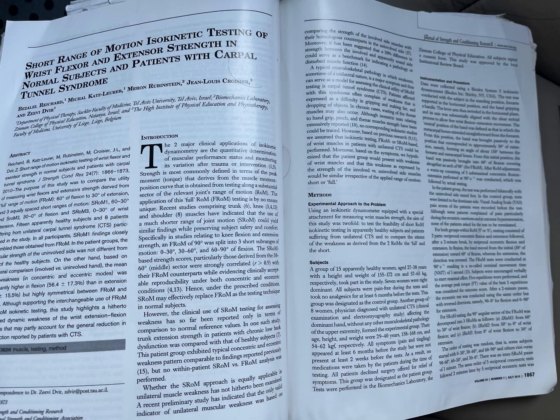Instrumentation and procedure. Data were collected using a Biodex System 3 isokinetic dynamometer, Biodex, Inc., Shirley, New York, USA. The test was conducted with the subjects in the standing position, forearm supported in the horizontal position, and the hand gripping the handle. The lever arm thus swiveled in the horizontal plane, and its axis was substantially aligned with the ulnar styloid process to allow free wrist flexion-extension movement.